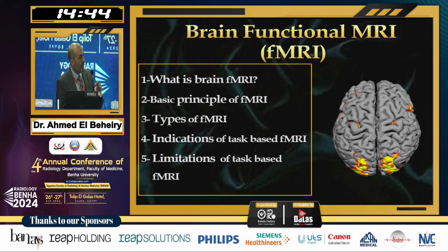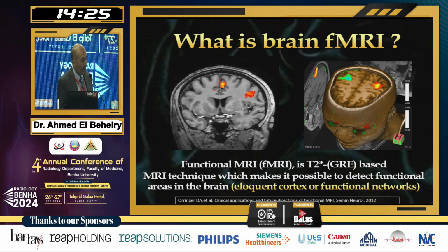As regards functional MRI, I'll mention 5 main points. What is meant by functional MRI? What is its basic principle? What are the 2 types of brain functional MRI? Ending by the indications and the limitations of the older technique, which is known as task-based or paradigm-based fMRI.